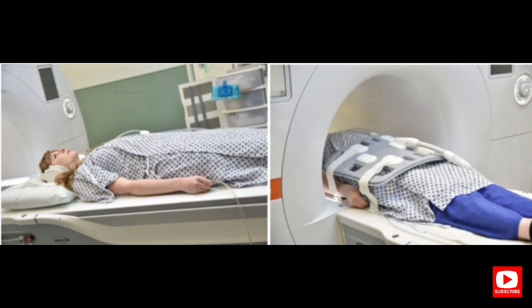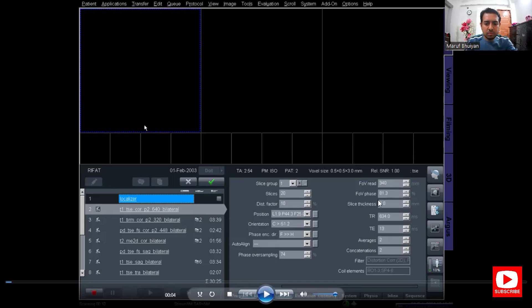Position the patient in supine position with head pointing towards the magnet. Position the patient over the spine coil and place the body coil over the pelvis so that the coil covers the area from the iliac crest down to the mid thigh. Center the laser beam over the hip joint, which is four inches below the iliac crest.